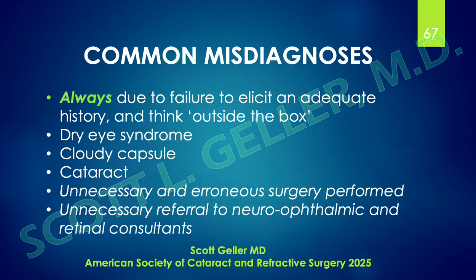It's especially so if they've had a refractive lens exchange, I guess we could call it now, or non-cataract cataract surgery, and they've been talked into a $2,000, $5,000 multifocal implant that gives them the vision they had when they were 25 years old, or at least that's what they're told, and they come out of the surgery. It's like, yeah, I'm sort of out of glasses, but I still can't read close, and I still have this thing in my vision.